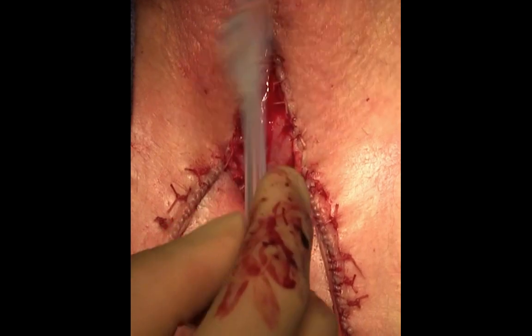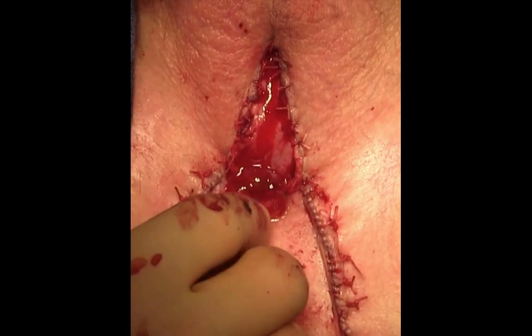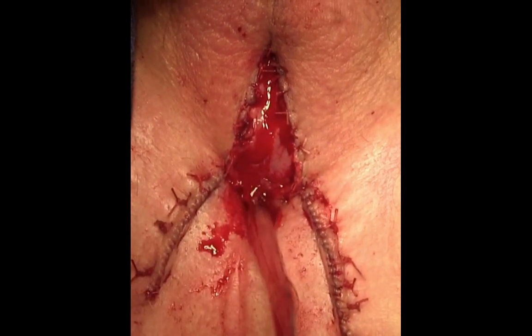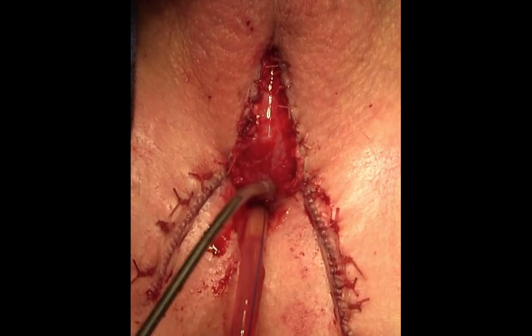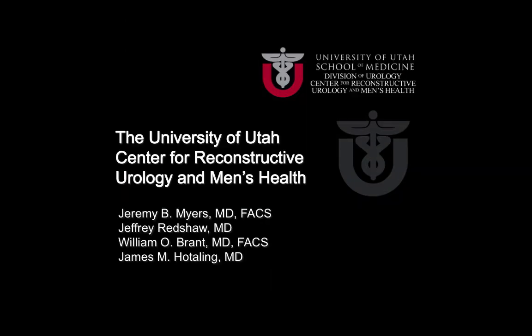Here is the final appearance of the perineal urethrostomy. It's completely closed. A catheter is placed through the perineal urethrostomy. We typically keep this in place for 2 weeks while wound healing occurs, and it can be kept longer if there's delayed healing.